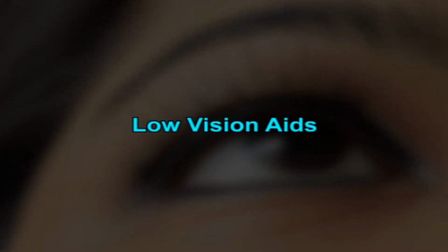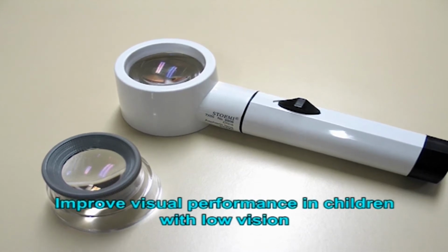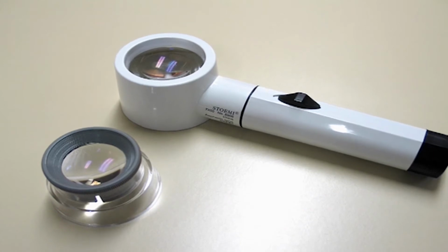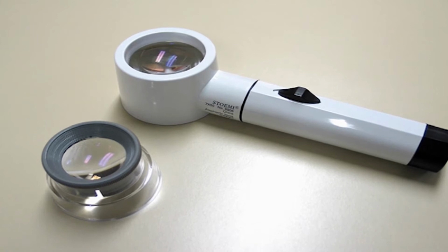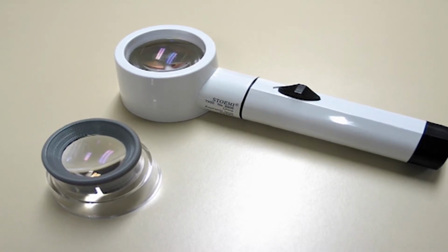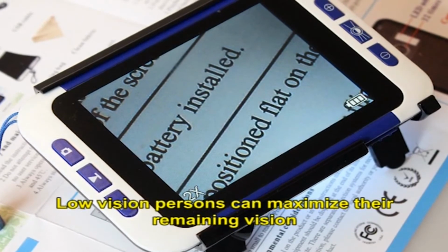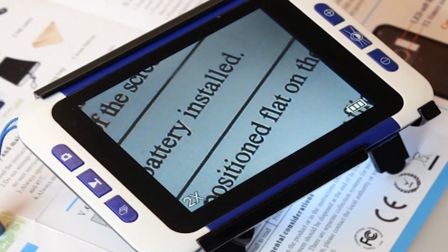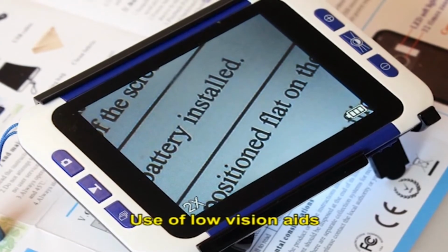Low vision aids. Low vision aids are designed to improve visual performance in children with low vision, thus enabling academic and social adaptation and providing enrichment of daily experiences. Low vision persons can maximize their remaining vision and develop strategies that lead to a more independent lifestyle through the use of low vision aids.